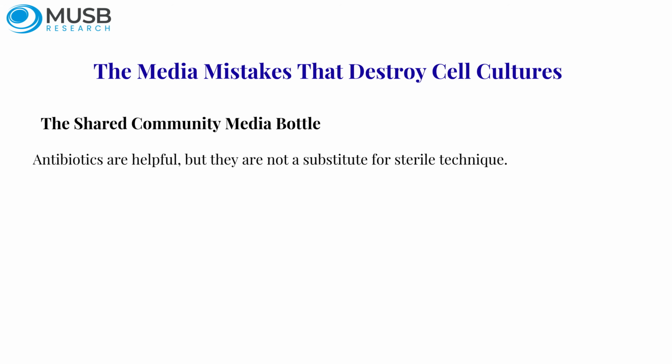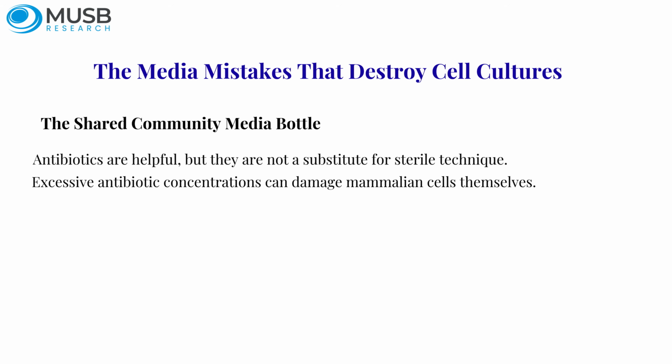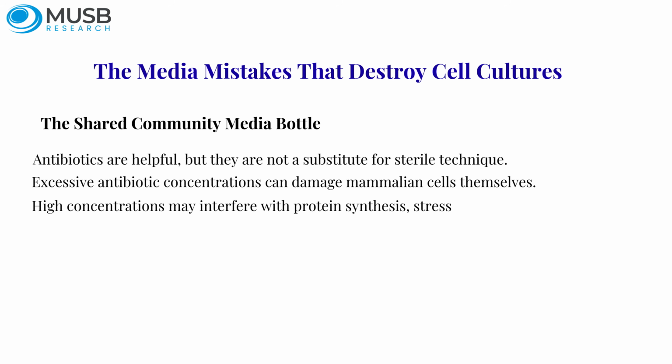Many new researchers assume that adding extra antibiotics will make cultures safer. In reality, excessive antibiotic concentrations can damage mammalian cells themselves. High concentrations may interfere with protein synthesis, stress cellular metabolism, and alter experimental outcomes.